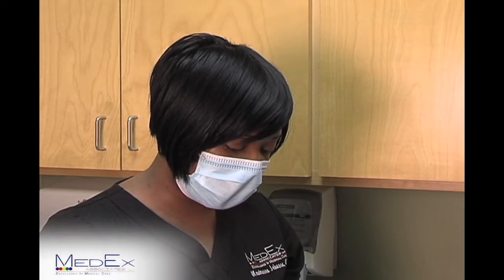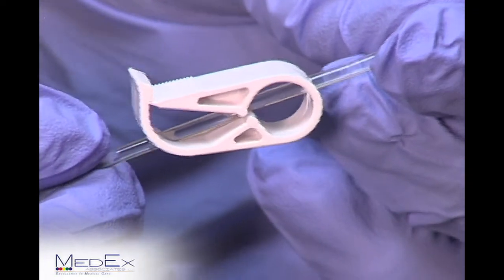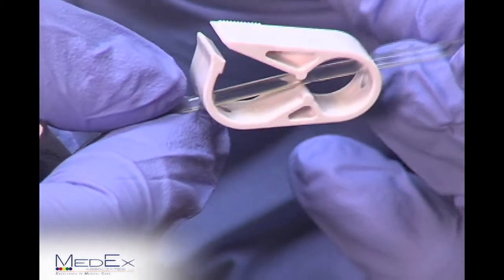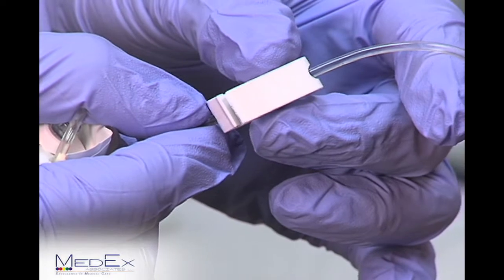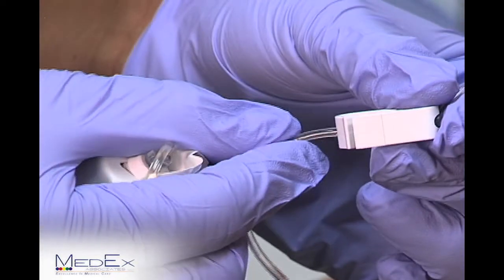Next, you want to release the clamp on your antibiotic. To do so, you begin by pulling the lip back until you hear a click. After that click, there will be a kink in your line. You'll move the clamp forward and firmly press on the line to remove your kink.